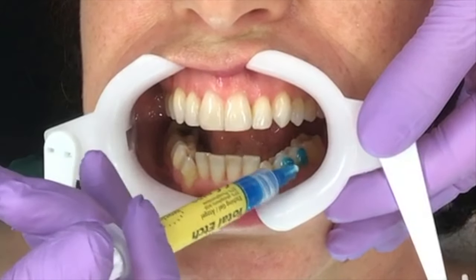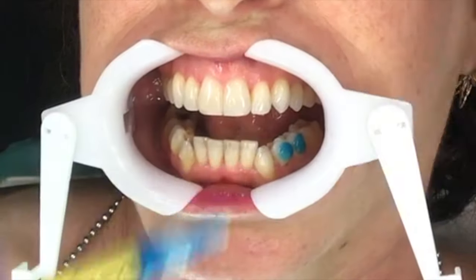The dental team reviews the attachment placement template, calling out tooth numbers: 34, 35, 43, 44.